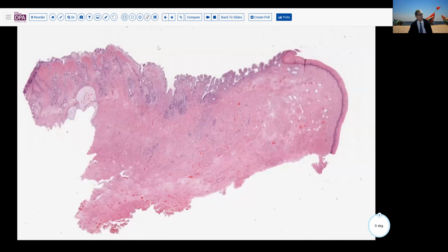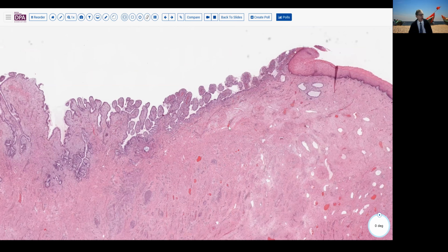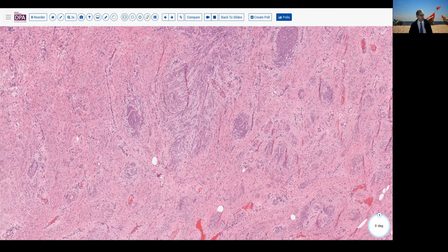So I was somewhat taken aback when looking at this cervical section. We saw this slightly raised area here. Over here we can see fairly normal appearing endocervix, with a nice sharp squamo-columnar junction. But I began to be struck by some features which were a little unusual: there are these strands and bundles of smooth muscle here, and they're haphazard, not really organized into any fascicular architecture.